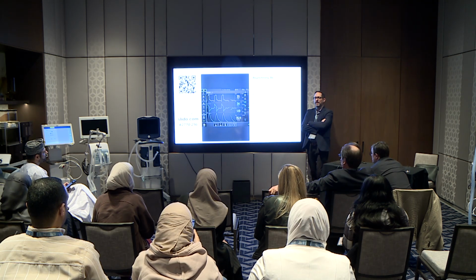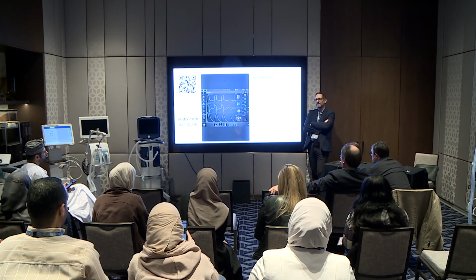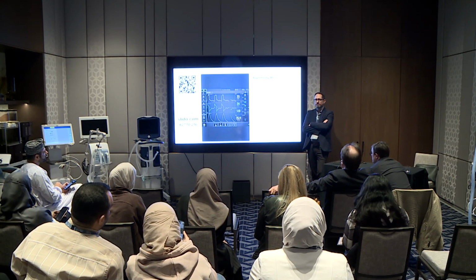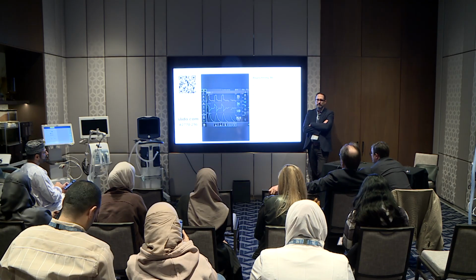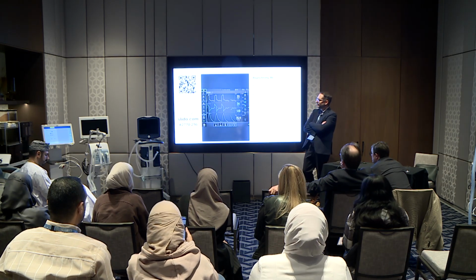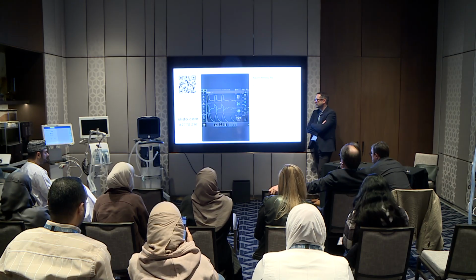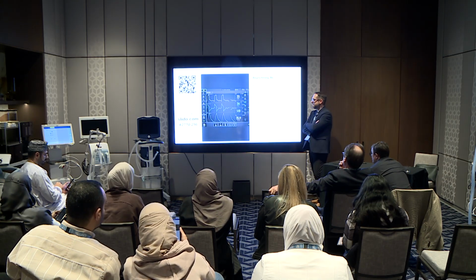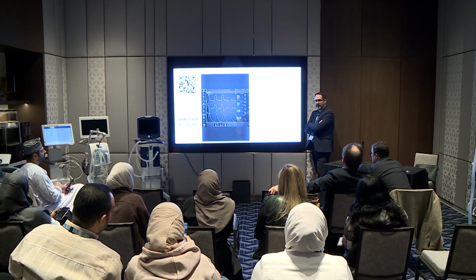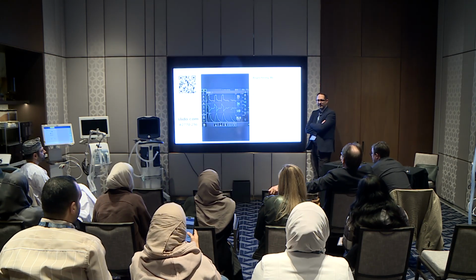What can you say about the patient's respiratory rate? Now, to know the answer to this, you'd have to understand what asynchrony you're seeing right now.